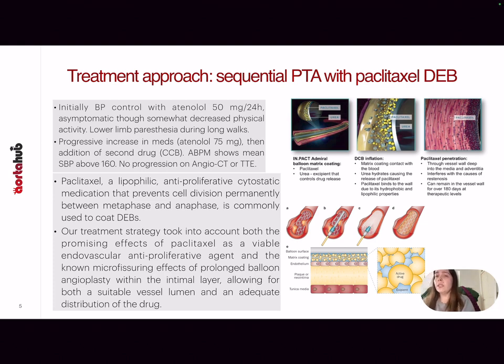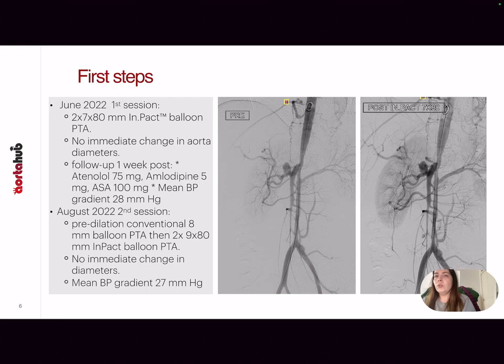And so we decided to take a stepwise approach for this patient and use a drug-coated paclitaxel balloon. And we started treatment in June 2022.